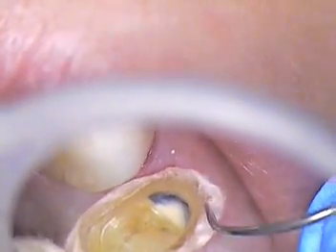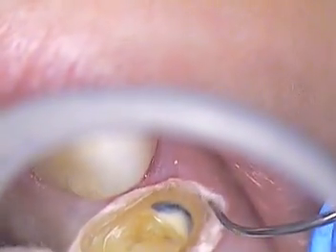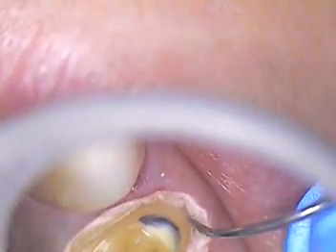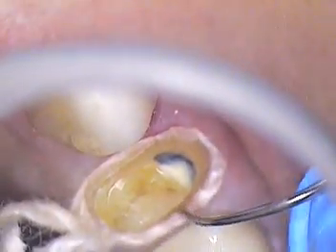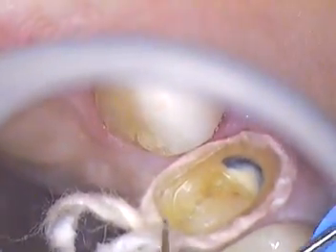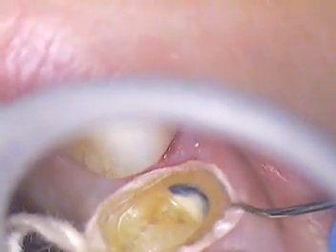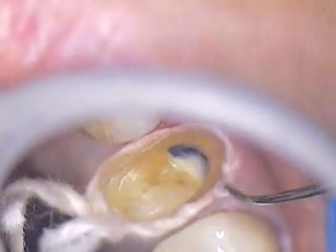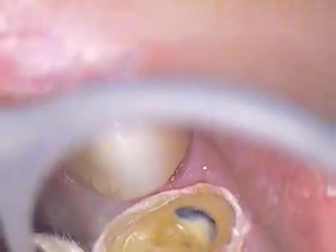A lot of you would probably want to just go ahead and scan the tooth and its margin. It takes us six minutes to get an impression and my temps are already ready to go. Scanning and fabrication in one appointment — I'm sure there are plenty of pros and also some cons. I haven't delved into that technology yet; I just waited and waited for more of an HD level of scanning, and now that we have some new scanners coming out I'll take a look at them. We're going to go ahead and let her sit for five minutes by the clock.